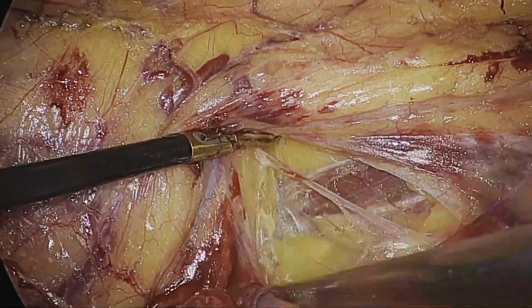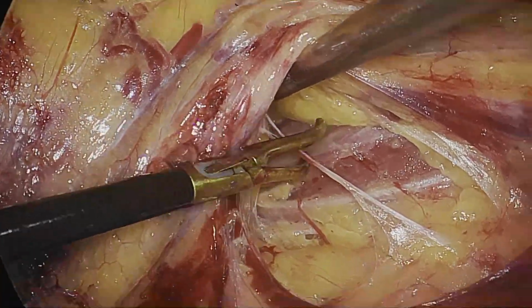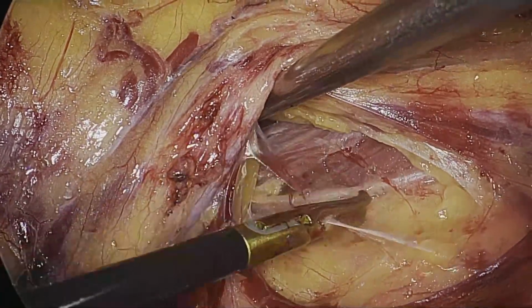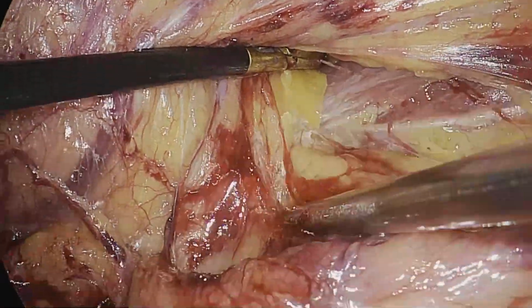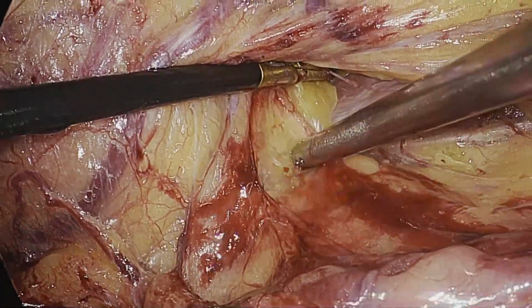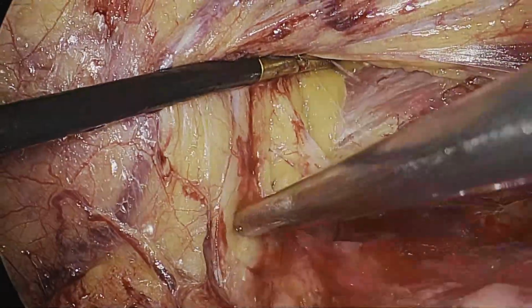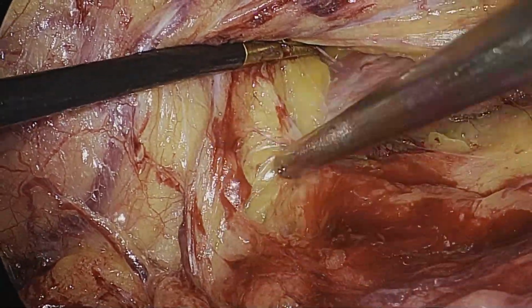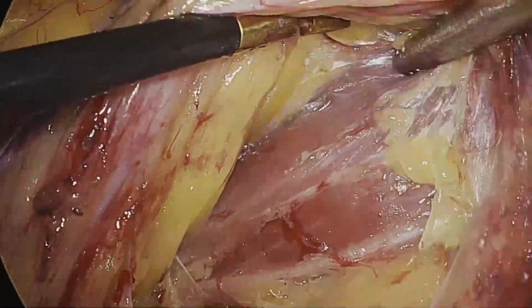Now the psoas muscle has been identified, and we would want to walk over the psoas muscle, and the gonadal vein and ureter are lifted with the fat above, and the fat in this golden triangle area is not breached at any place. We would want to keep this covering completely intact.